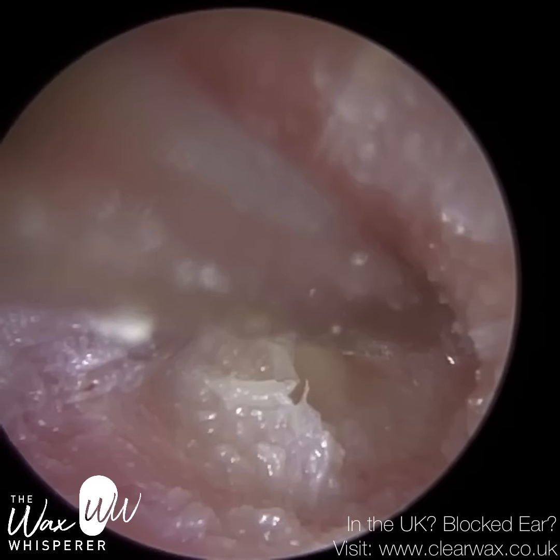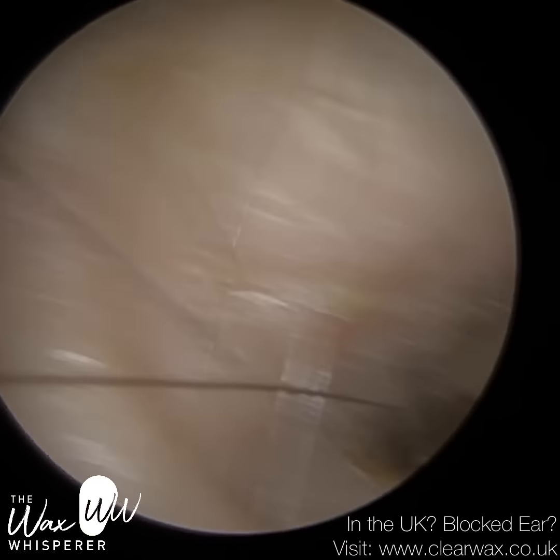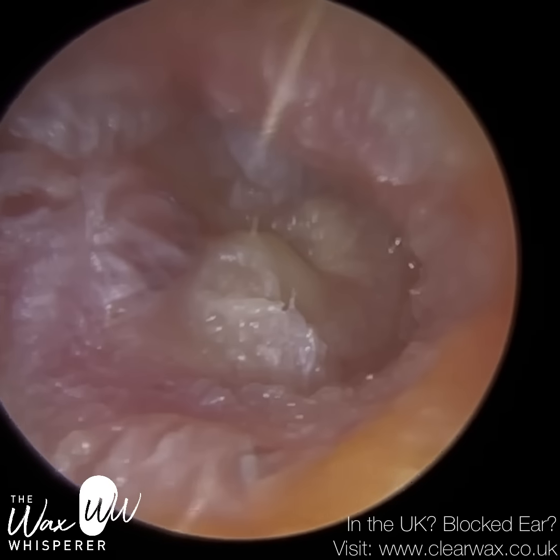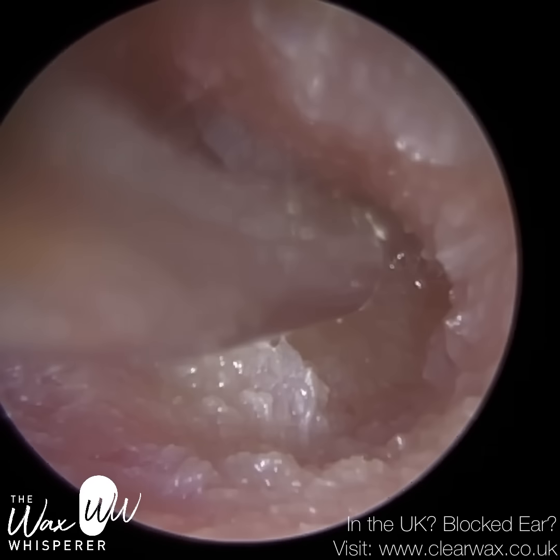So think about a water balloon. If you put too much water into the water balloon, eventually it's going to reach its max capacity and the water balloon is going to pop. And again, you can probably see that even from here. It's popping away, it's beating away, this eardrum.